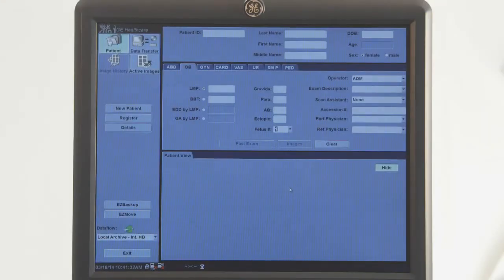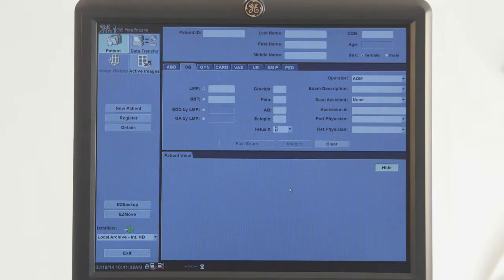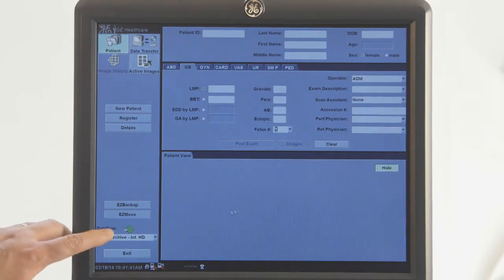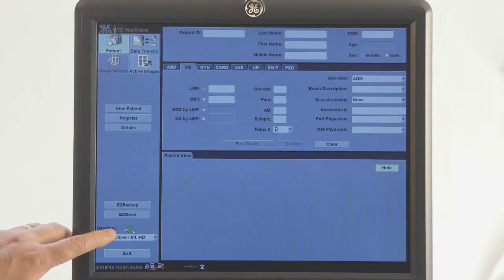A recommended practice is to keep the hard drive less than 50% full. You can check how much free space is on your hard drive by hovering over the green circle on the lower left of the patient information page.